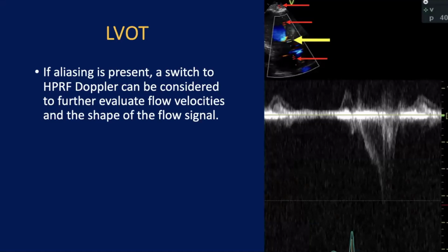Like, how many pulses do we have here? This is the high pulse repetition frequency. Whenever you have a high velocity, the machine will give you all of these pulses. It can still give you the pulse at that place, but they say it still has range ambiguity. But from the shape of the pulse, you can know where it is. I don't know if it is useful. Do you think it's useful, or how much do you depend on that?